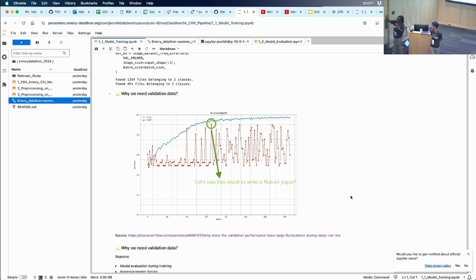There's a way to communicate these results that shows whether this makes sense or not, beyond just an AUC of 0.99. And you're running so many experiments. So our students use the Weights and Biases framework and log all the experiments in there, so that if we want to go back two days to see what was there, it's easy to pull up these loss curves and everything else.